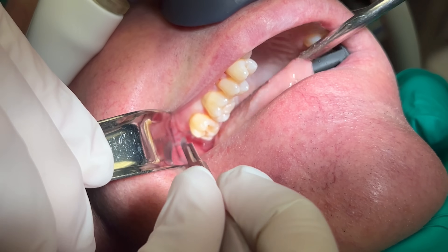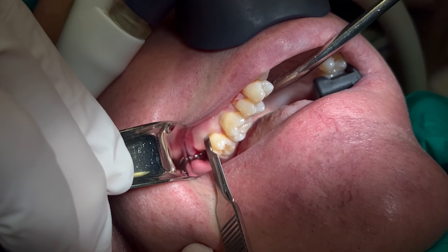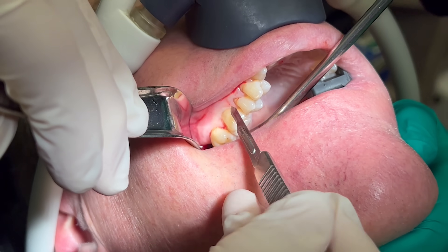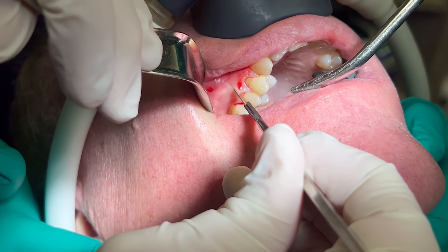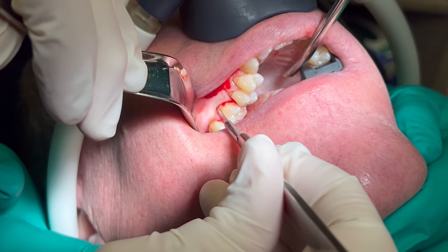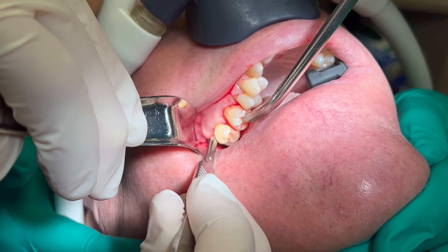Once this patient is asleep and anesthetized, I make a full thickness incision along the sulcus of the teeth and create a vertical release anteriorly. I then elevate the flap and expose the lateral wall of the sinus.